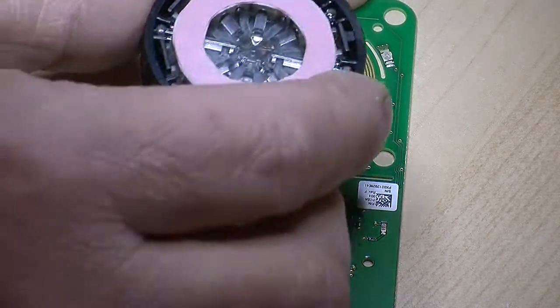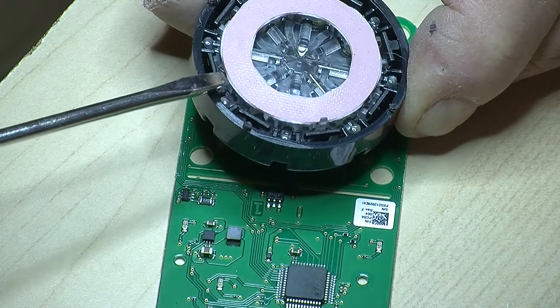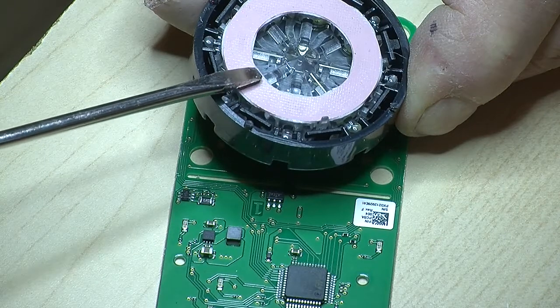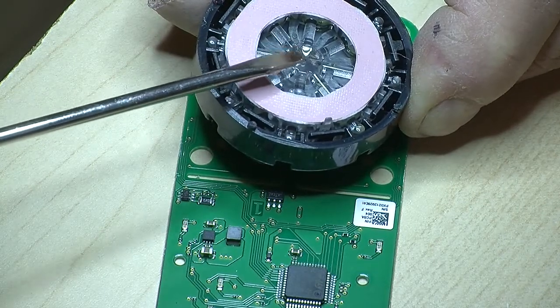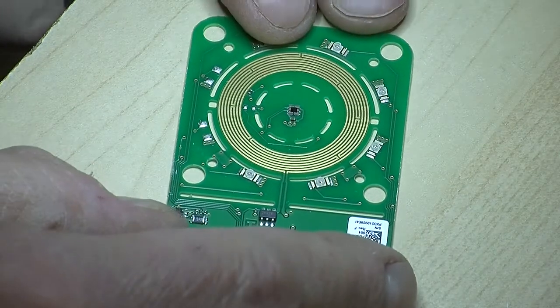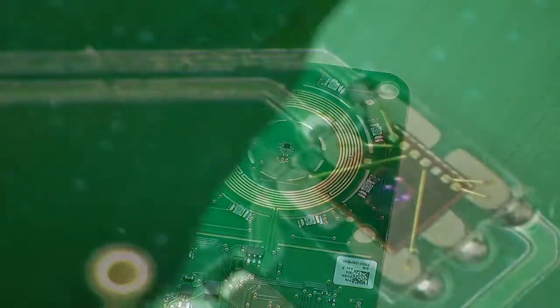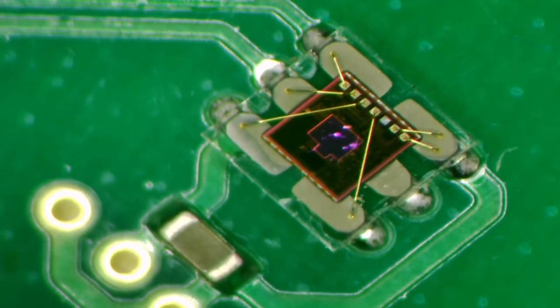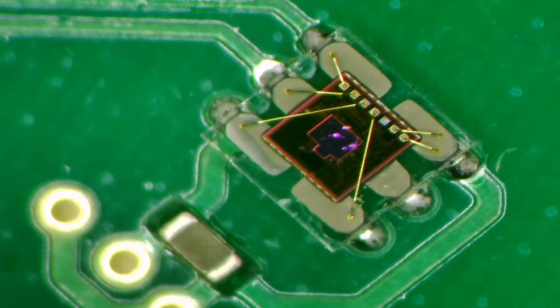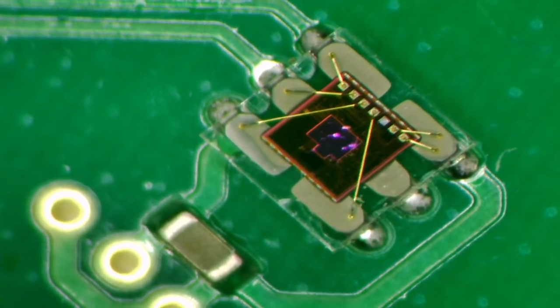And if we look at the plastic thingy over here, what seems to happen is you get the light from the LEDs coming in these plastic channels and being guided right towards the center part of the system. And if we look back at the circuit board, we'll see right in the middle of the circular bullseye is in fact another IC. And there it is. And it actually does seem to have a bit of a hint of color to it. I'm not sure if that is some sort of a color filter, or whether it might be some sort of interference pattern based on layers of the chip. But my guess is it is some sort of a color filter.